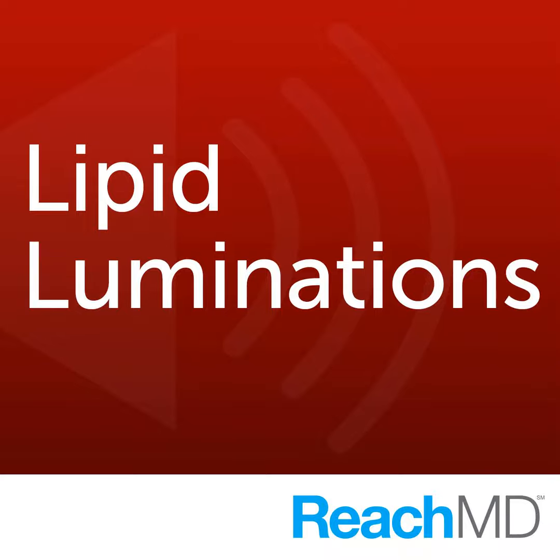And that, again, leads to the reproducibility question about carotid IMT that you mentioned. And so the thing that makes it difficult to do is what part of the carotid you measure. The common carotid is the most reproducible part of the carotid artery. The internal carotid is much more difficult to evaluate, even though that's what was looked at in all the clinical trials, is a combination of different parts of the carotid. For practical clinical use, I think the common carotid is the best to look at, and you should look at a combination of both carotid IMT and carotid plaque formation. And then you have the advantage of no radiation exposure compared to the calcium score, correct?